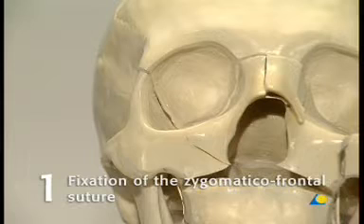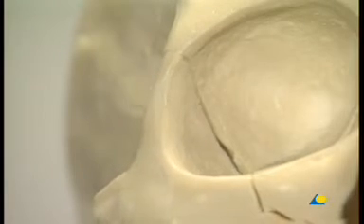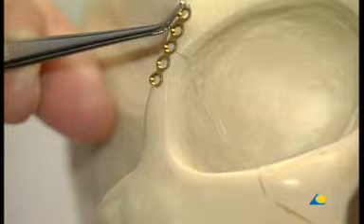Fixation of the zygomatico-frontal suture. The procedure begins with reduction of the zygomatico-frontal fracture and the application of a 5-hole 1.3 adaptation plate. The plate is contoured with the bending pliers and is positioned so that a single screw is placed on each side of the fracture at this stage.